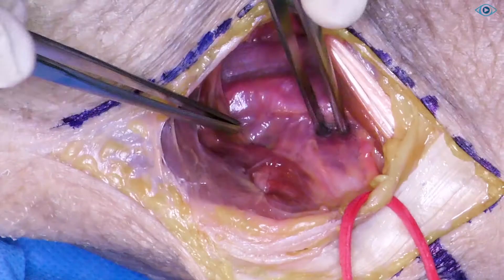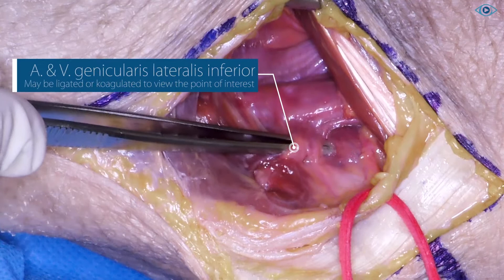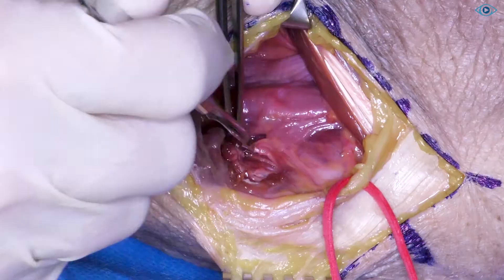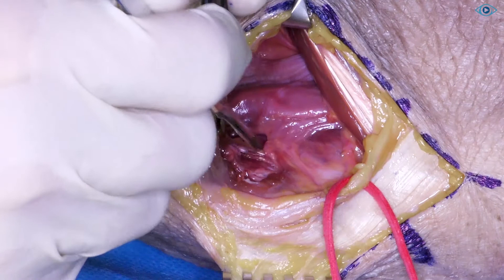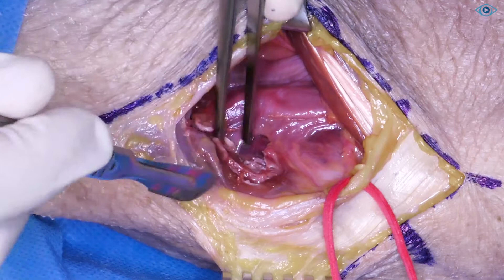Here we see the triangle where we have to go in. This is the neurovascular bundle. Here we see a small branch of the popliteal artery — the lateral inferior genicular artery — with its corresponding vein. It needs to be ligated or coagulated to reach the posterolateral tibial head here in the deep. We now carefully dissect the soleus off the fibula head without damaging the peroneal nerve, and at the end of the operation it will be reattached. Under protection of the peroneal nerve, the soleus opens up a field behind the head of the fibula.